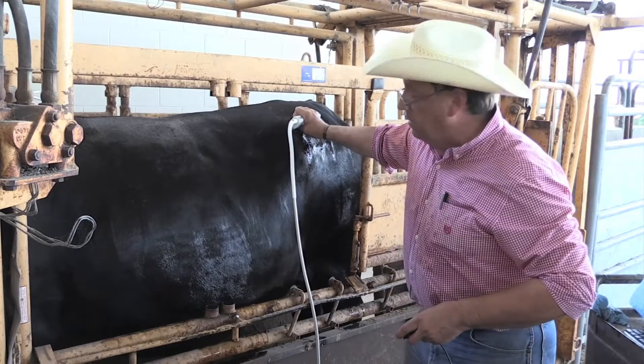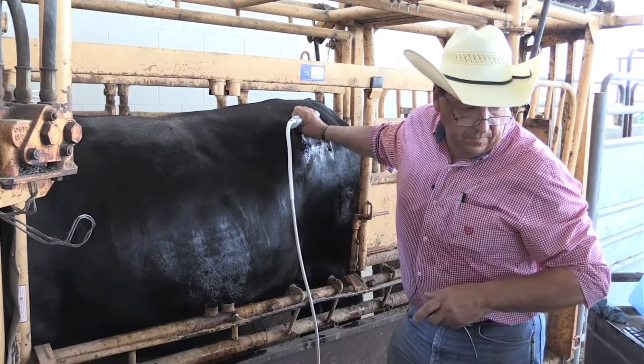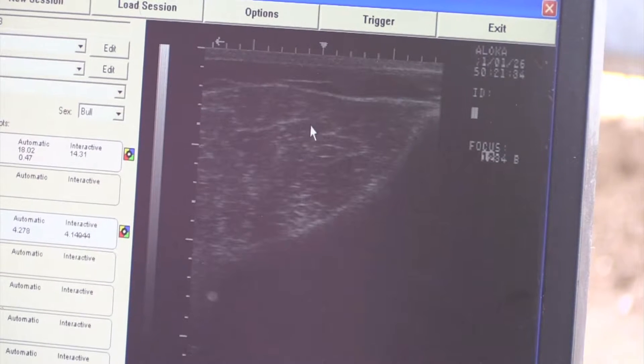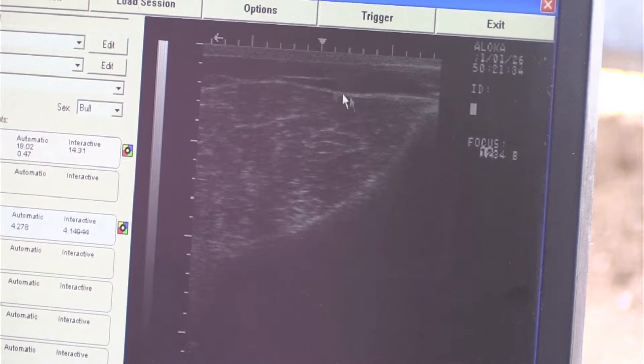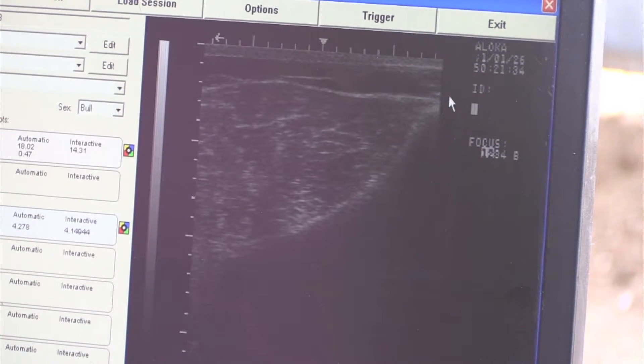It's a pretty quick, simple image to pick up — just freeze it. We're comparing this rump fat here. It's hard to tell sometimes, but there's a line that runs between the two muscles, and where the two muscles meet is where we measure. Usually you'll see a dip in this rump fat. This curvature over here is the curvature of the pelvic bone, and this is the hooks right here.